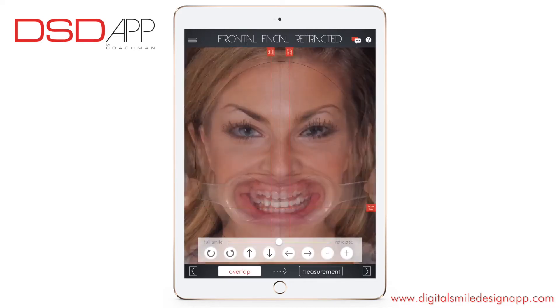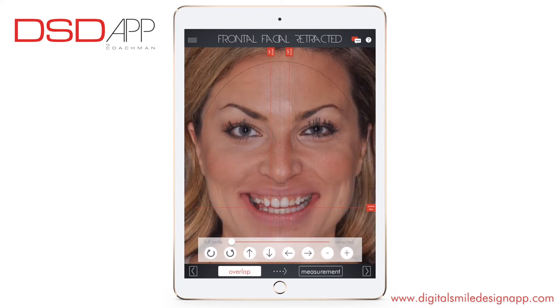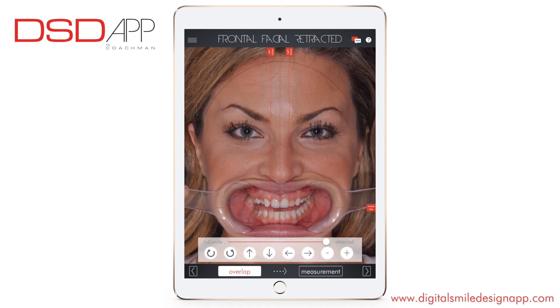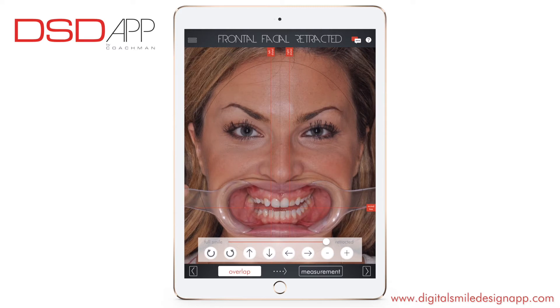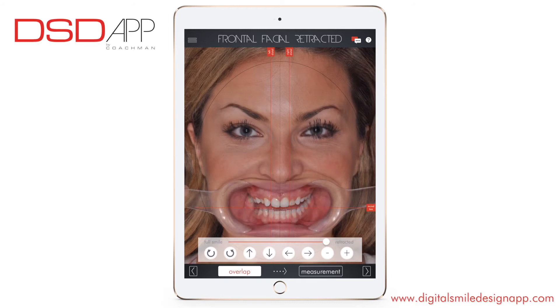Now we are scanning the retracted picture. Moving the opacity slider from right to left will display the full smile picture or the retracted picture. Adjust the position and size of the retracted picture. Make sure the overlapping is as good as possible — only concentrate on the mouth area.